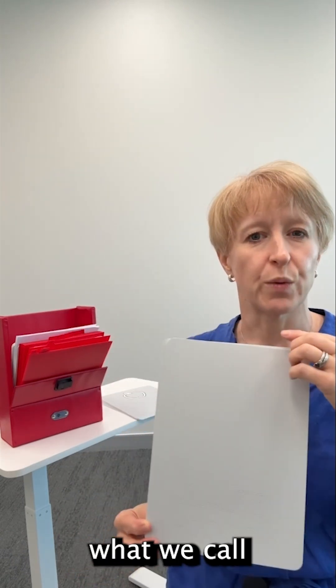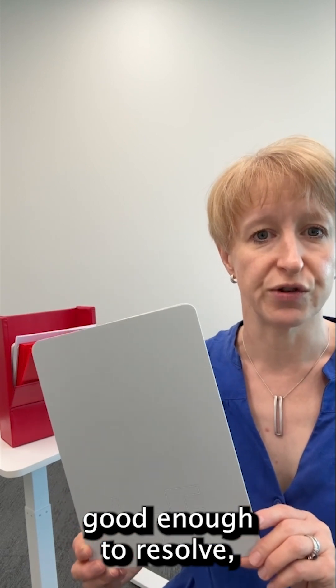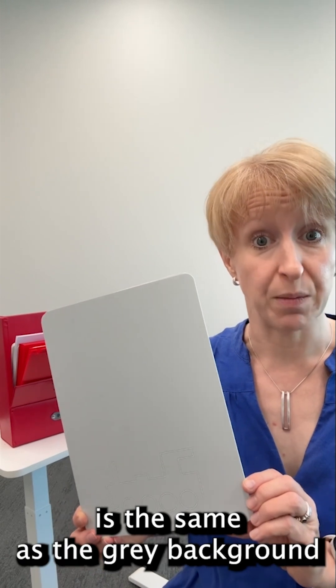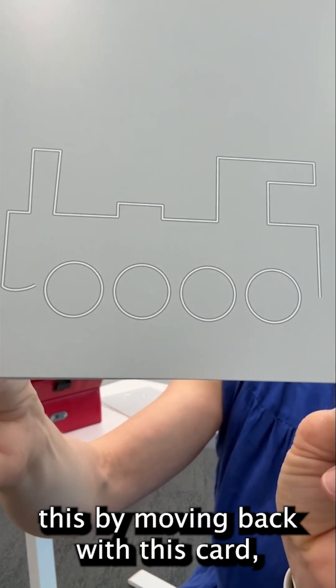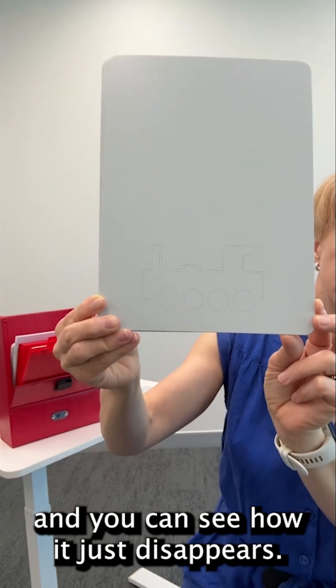However, this assessment uses what we call vanishing optotypes. If your vision isn't good enough to resolve — that is, to distinguish these lines from each other — then their combined luminance is the same as the grey background and they seem to just disappear. I can demonstrate this by moving back with this card and you can see how it just disappears.